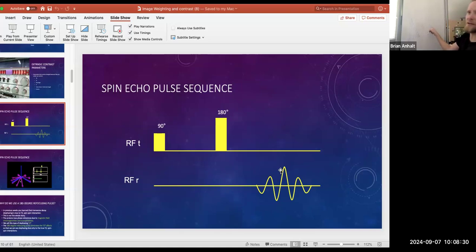That is more symmetrical. So K-space needs to see the signal grow and then go away. That's one of the things that needs to happen. So if I were to take this and put it in K-space, I would have symmetry. This does not have symmetry. Following me?